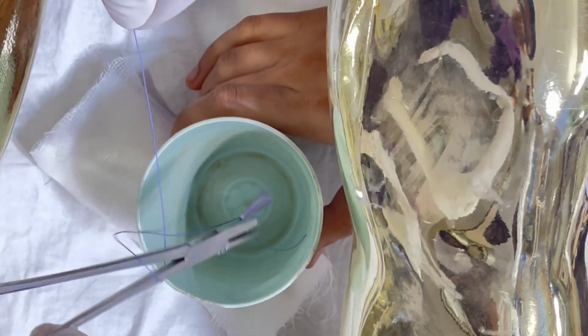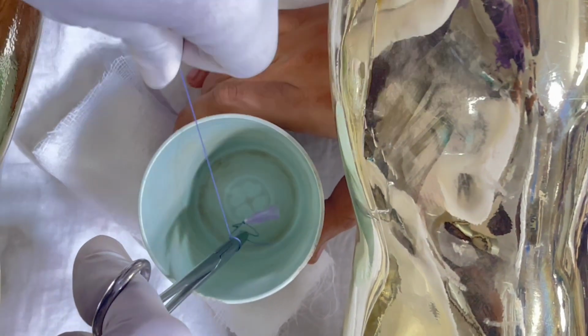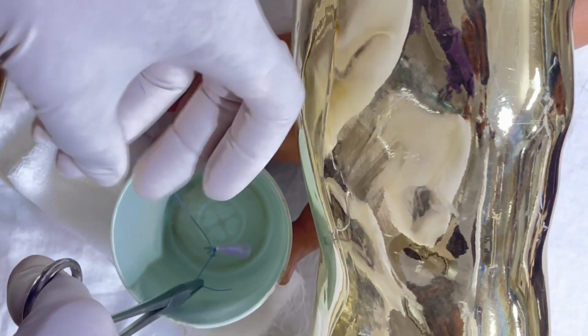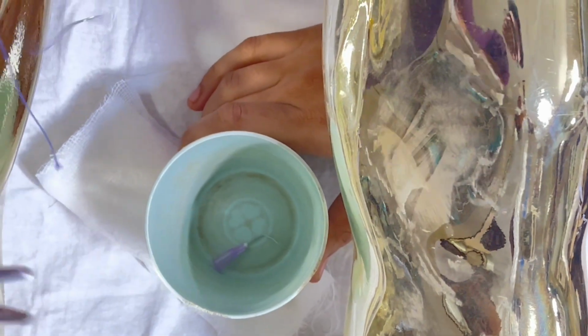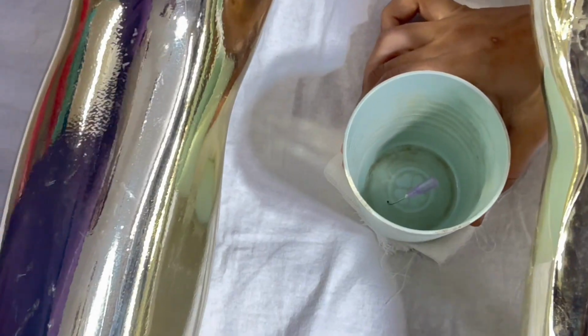Without the hook coming out, I have to suture and slide my finger inside. So this is the way to demonstrate the skill of suturing in the depth, especially if I give more traction, that hook will come out. So that is the way to demonstrate the hook suturing in the depth. So it can be one of the suturing with the hand instrument. It can be demonstration of suturing around this hook.